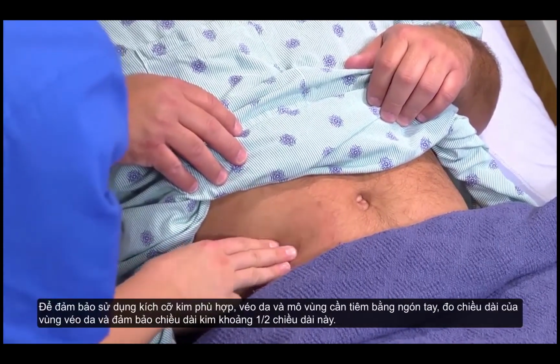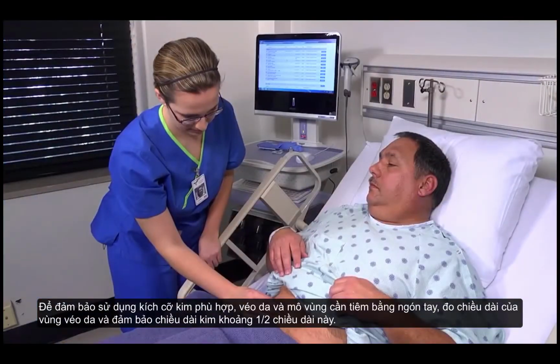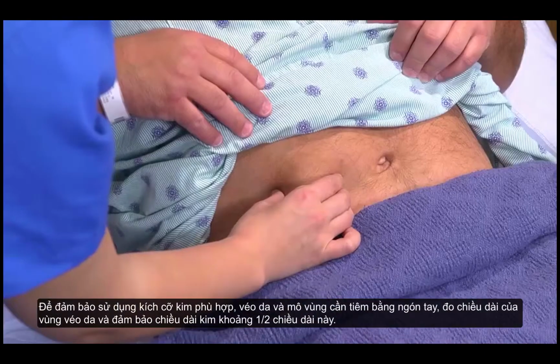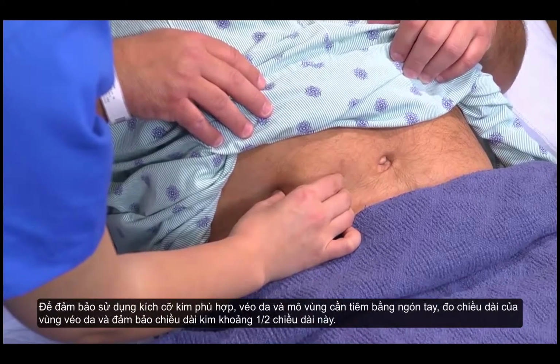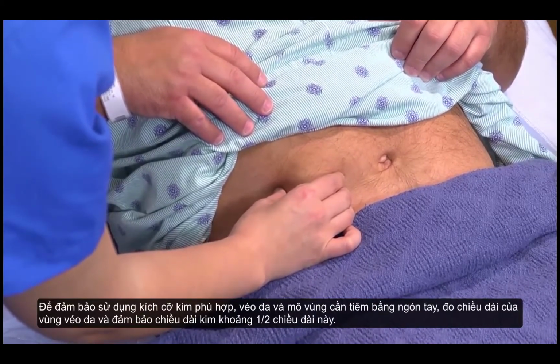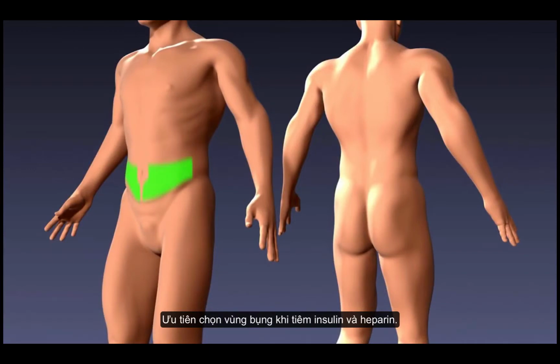To make sure you have the right size needle, use your thumb and forefinger to grasp a skin fold of tissue at the injection site. Measure the fold from top to bottom and check to ensure that the needle is about half as long. Give preference to abdominal injection sites when you're administering insulin or heparin.